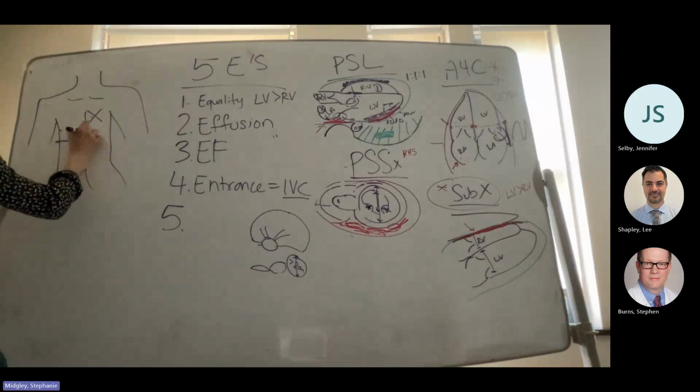the epigastric area, or your side view, and now you're just in transverse. Right? So here's my liver, and then here's my IVC coming in. So I'm just right over here.